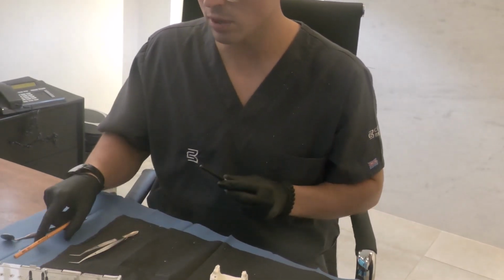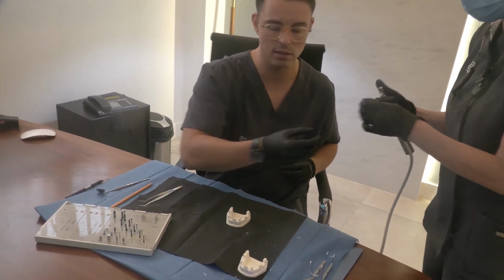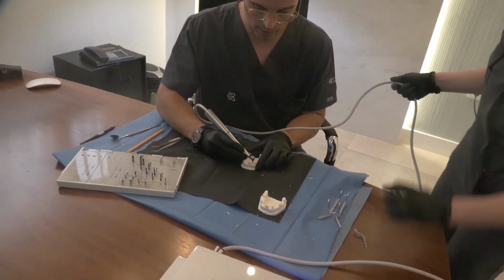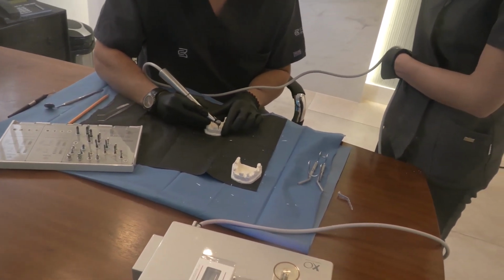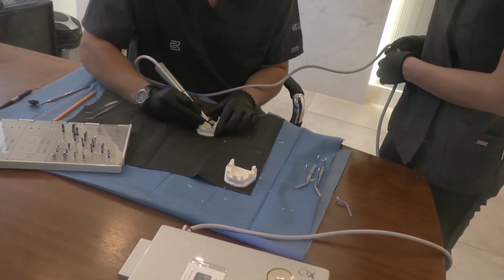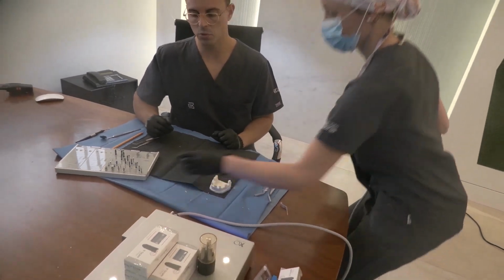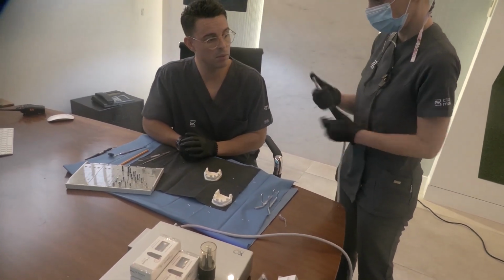And then the drilling sequence is going to be exactly the same, very intuitive. First of all, we start at 900 revolutions per minute in the central area. Okay, and check yourself whether the implant position is being drilled in the desired area, always considering that the emergence profile should be at the level of the cingulum in order to make a screw retained prosthesis.